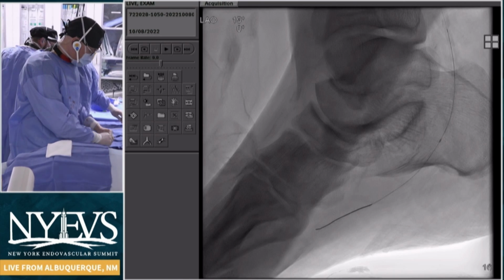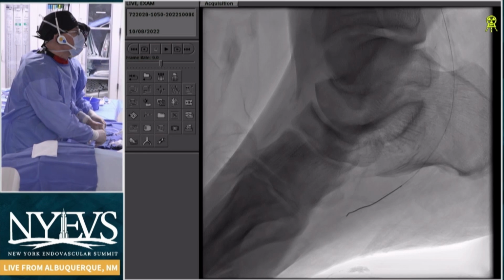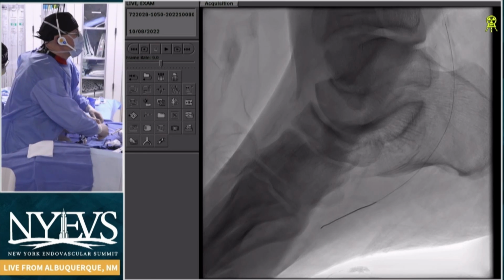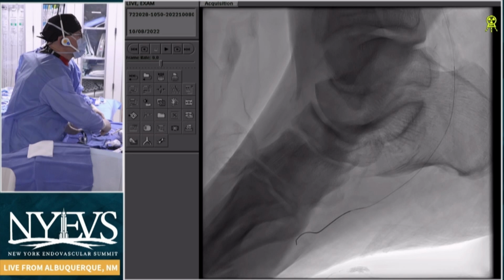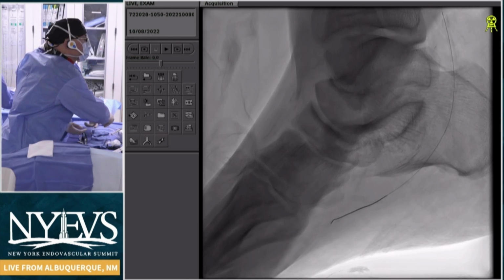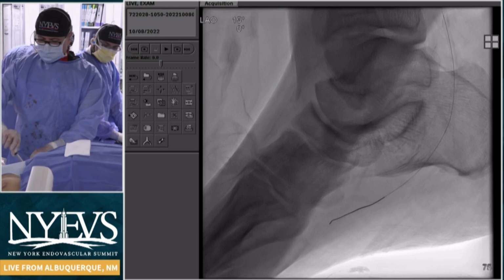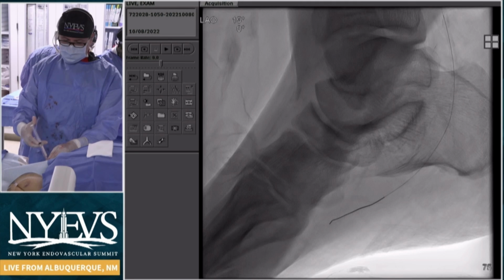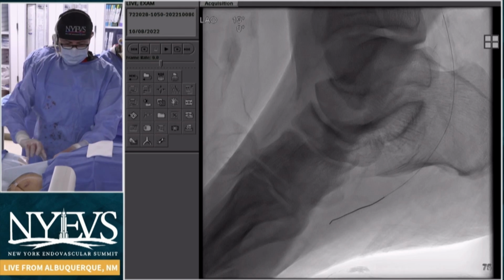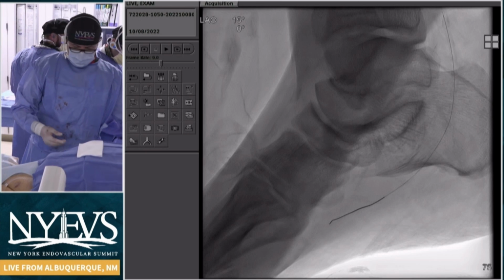I completely agree, and to echo everyone else's words here today, I think you tend to get more aggressive if you know that they're going to the operating room for an amputation, to try and at least get them healing to a transmet as opposed to a whole foot. But again, everyone said it very well. You can really do a lot of damage here, so it's not something that should be taken lightly.